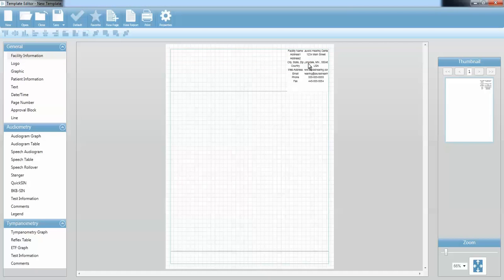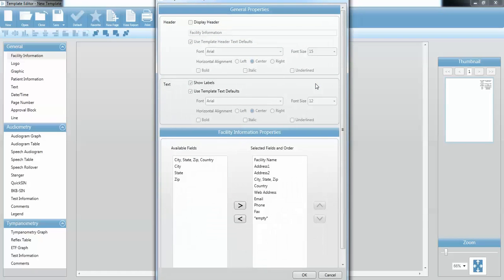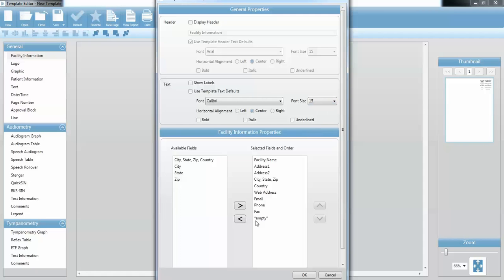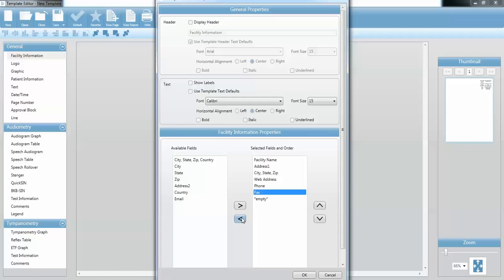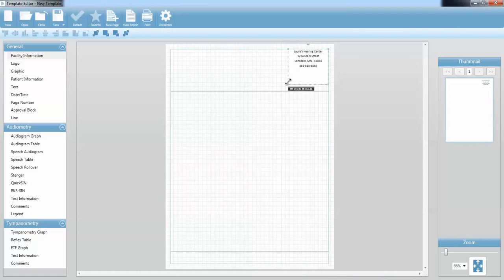I can right-click and go to Properties, and that will open up a General Properties window. I can also double-click on this component and it will pull up that same General Properties window. The first thing I'm going to do is uncheck where it says Show Labels — that gets rid of some extra information I don't need. It doesn't have to say Facility Name, Laura's Hearing Center — I can figure that out without the label. The second thing I'm going to do is change the font and the font size to maybe 15. Then I'll evaluate what facility information I actually need — I'm going to remove the address, country, phone number, fax, web address, and email because those are on my logo. Press OK, and you can see the facility box has changed based on what properties I took out or added.